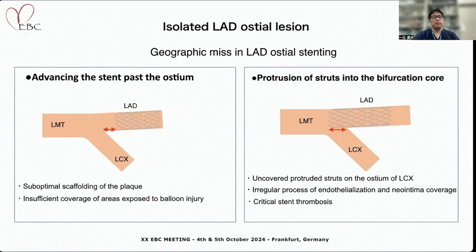The optimal stenting strategy for Medina 010 LAD ostial lesions remains unclear. However, geographic misses in LAD ostial stenting have a significant clinical impact. First, if the stent is placed too distally from the ostium, there would be increased risk of restenosis because of suboptimal scaffolding. On the other hand, if the stent is placed too proximally, protrusion of some struts into the bifurcation core may cause difficulties.